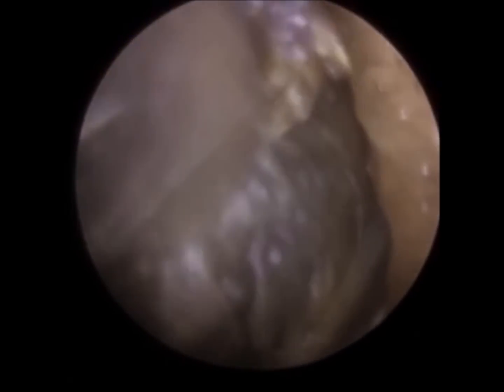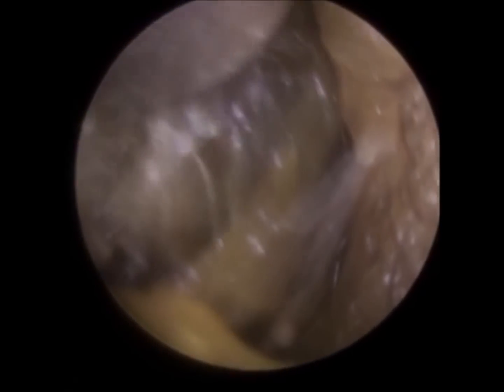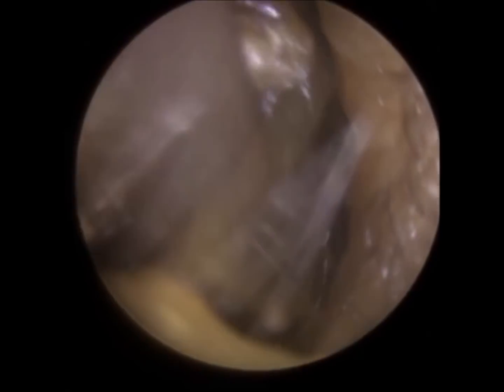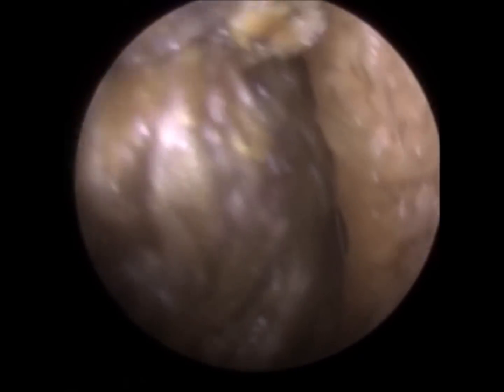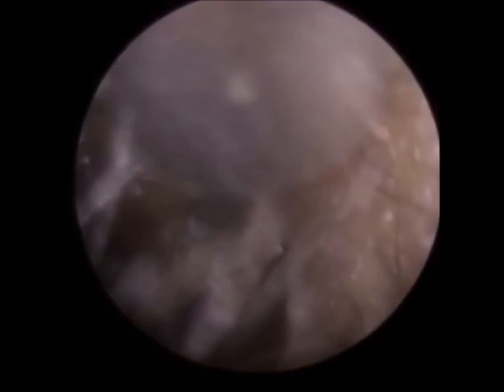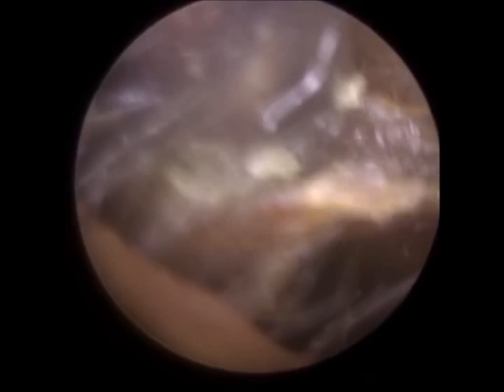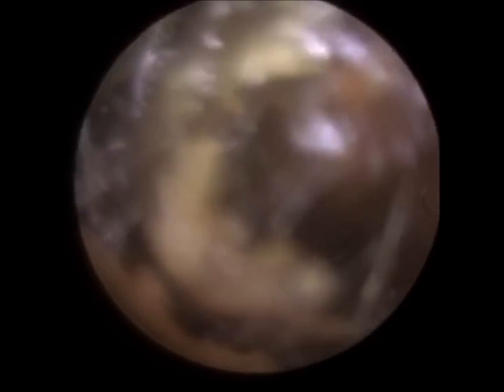Quite often people who suffer from wax are going to secrete wax again in the future, so it's a pointless exercise trying to get every little last speck out. By attempting to do that you can cause trauma and injury to the ear canal, and we would get questioned if the client ever made a litigation claim against us as to why we decided to remove every little speck of wax, because, as I say, clinically it's not needed.